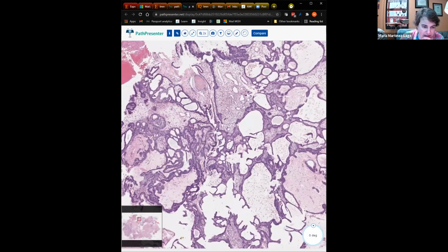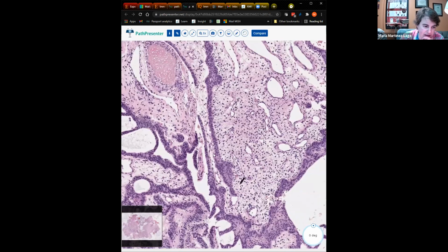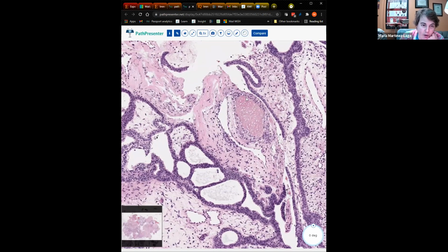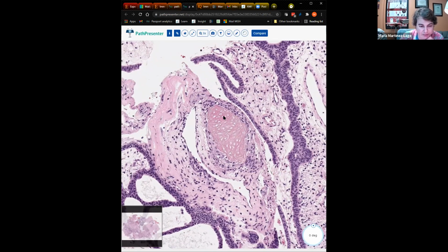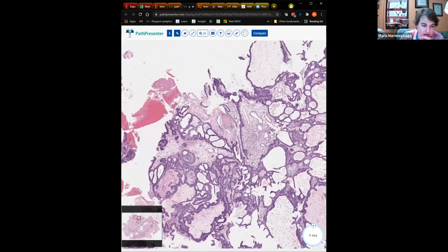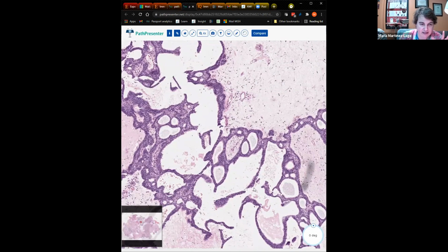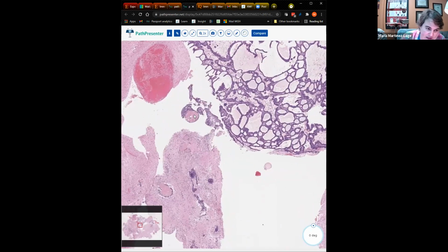Very typically has this squamous epithelium with basal palisading that is admixed with these areas of loose stroma, also known as stellate reticulum, and then very typically demonstrating what we call wet keratin. So these pearls of ghost cells that used to be squamous epithelium have lost their nuclei, and then eventually these areas of wet keratin become calcified. As you can see here, there's a lot of cystic spaces that end up in a confluent cyst, and they are very typically calcified as well.